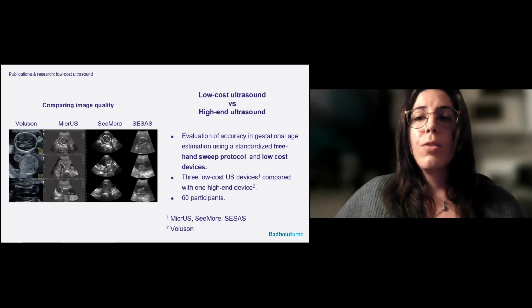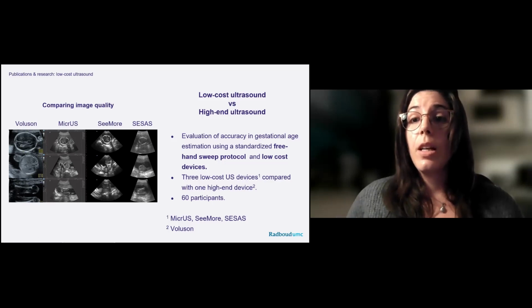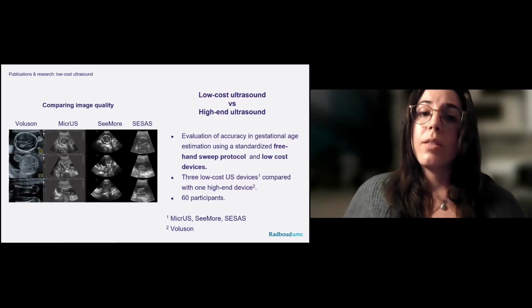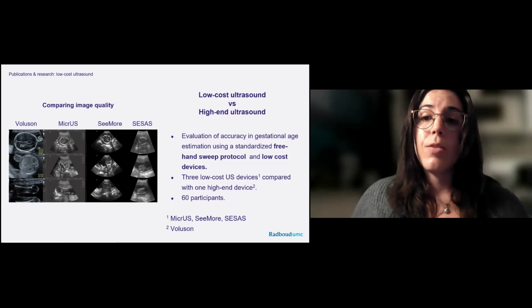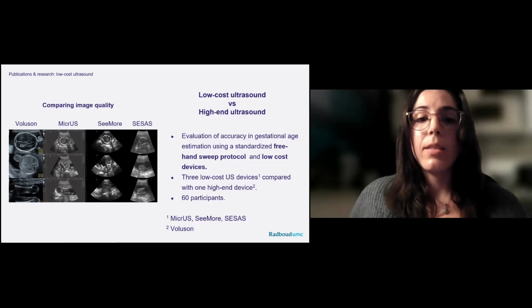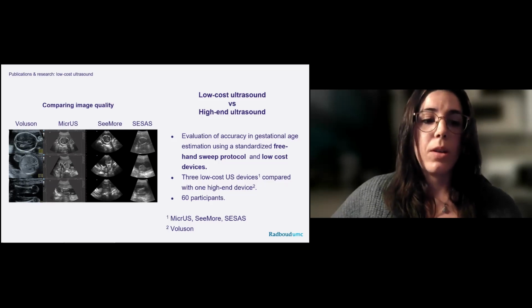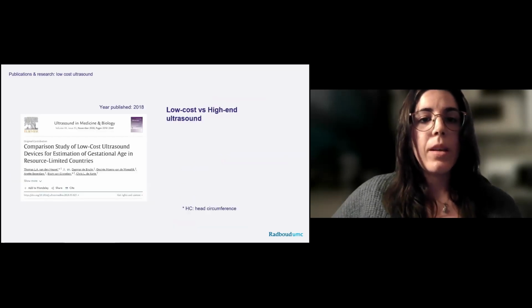And the main goal of this study was to evaluate the accuracy in gestational age estimation, both with images acquired with low-cost devices in comparison with the high-end device that's a reference used in clinical practice, as well as following the standardized protocol that I talked about earlier.